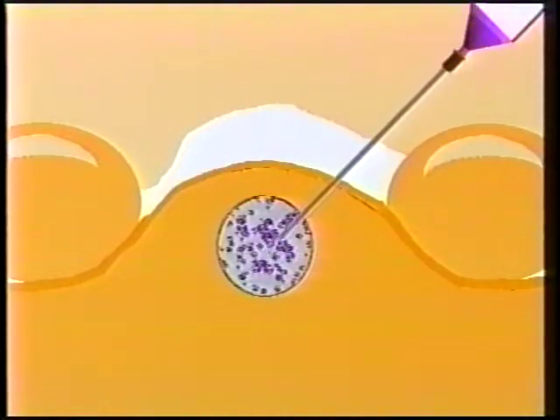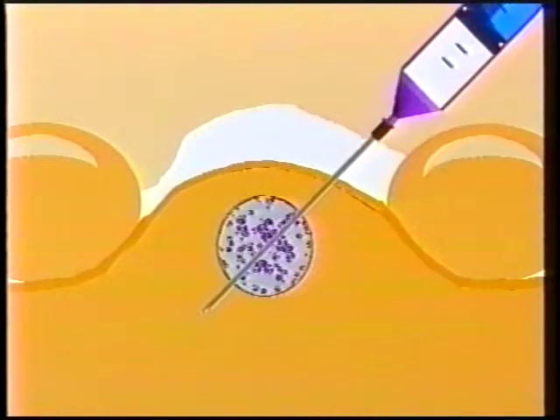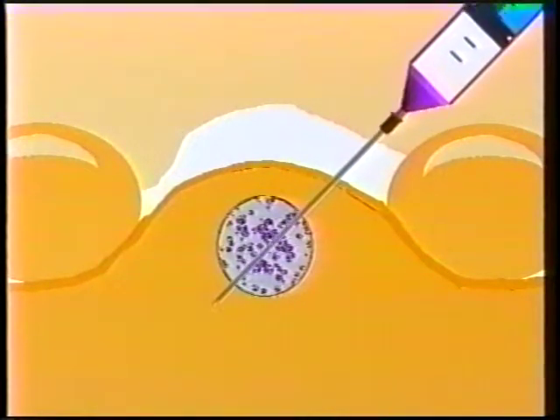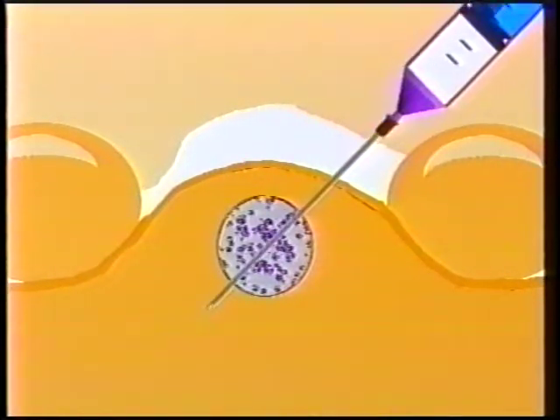There may be a tendency for the needle to penetrate a little deeper with each stroke. This will result in poor sampling because the needle tip will sample beyond the target instead of in it. Keep the size and the location of the target in mind and concentrate on moving the needle accordingly.